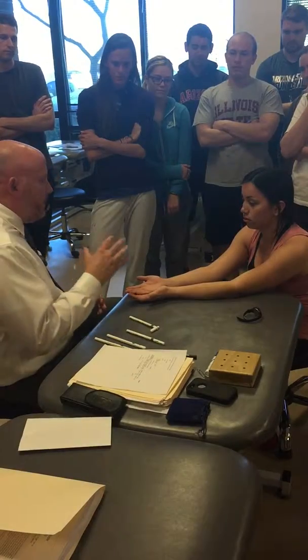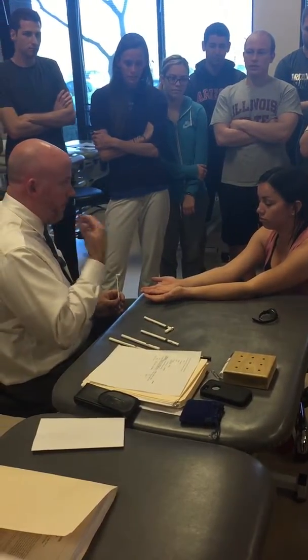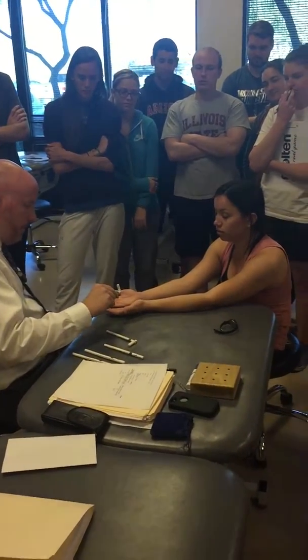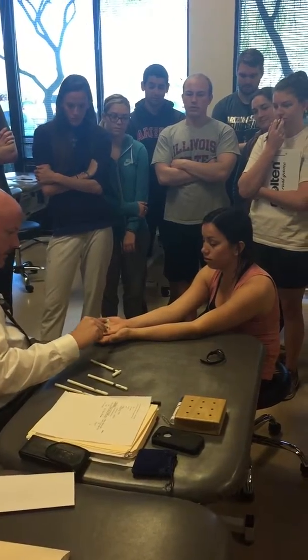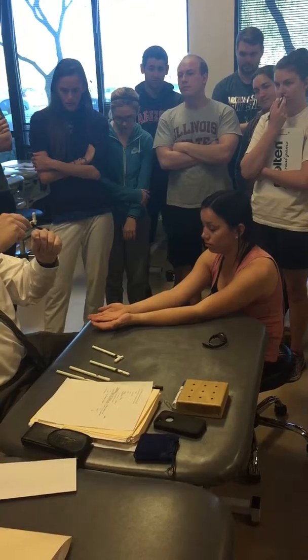Okay. So what I want you to do is close your eyes and I'm going to tap on your hands. And I just want you to tell me if you feel me tapping. You don't have to tell me where, but if you feel it. So then I'll start to tap, and I'm tapping to where I'm getting the monofilament to bend, okay?